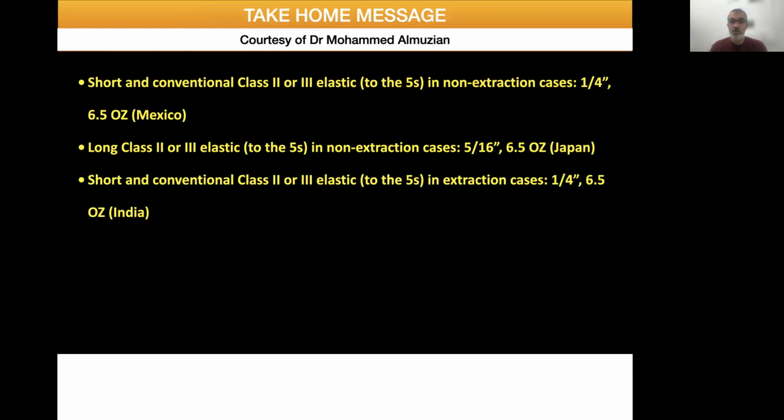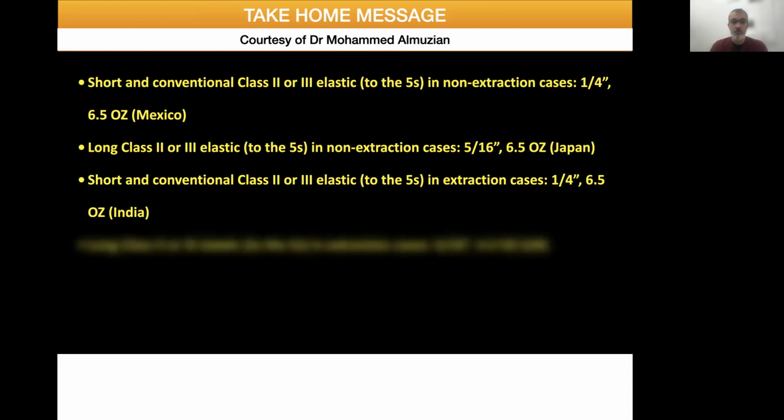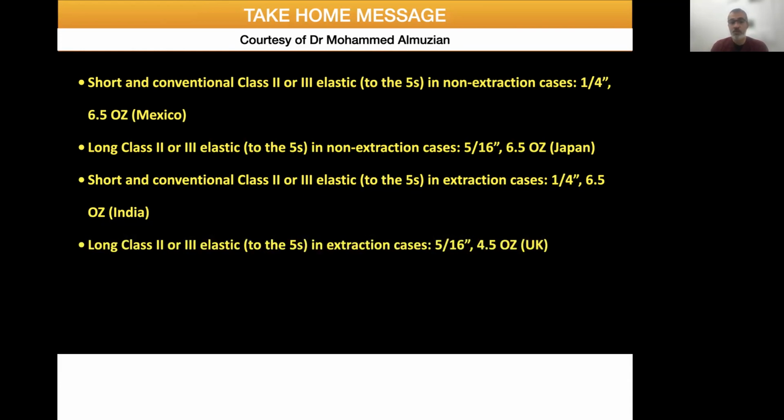If you are using a short or conventional class 2 or class 3 elastic, and the case is extraction, then you need a smaller diameter, and in this case 1/4 inch, 6.5 ounce is adequate, and you can use India. And of course, if you are using a long class 2 or class 3 elastic in an extraction case, then go for the UK. Again, this is the nomenclature used with some elastics. It might be different from company to company, but this is what OrthoCare are using.